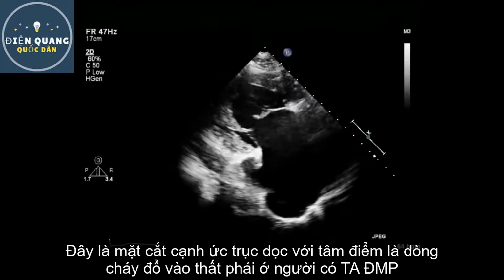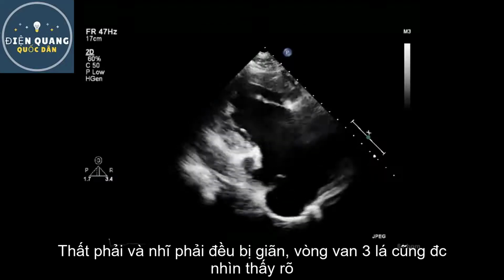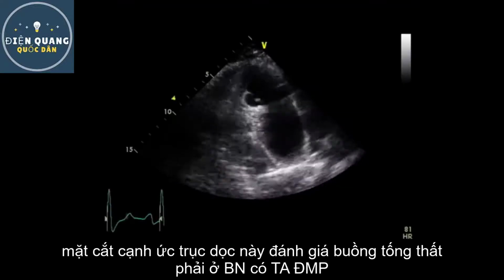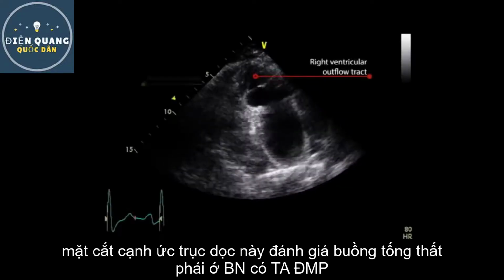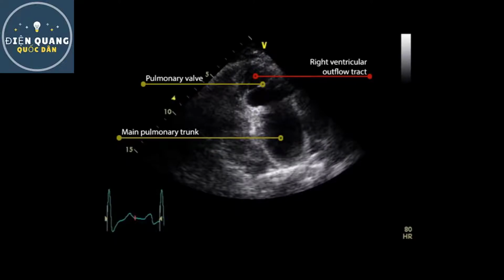From the parasternal long-axis view of the right ventricular inflow tract in a patient with pulmonary hypertension, dilatation and hypertrophy of the right ventricle, dilatation of the right atrium, together with tricuspid annular dilatation, can be clearly seen. From the parasternal long-axis view of the right ventricular outflow tract in a patient with pulmonary hypertension, we can see the dilatation of the pulmonary annulus and main pulmonary trunk.